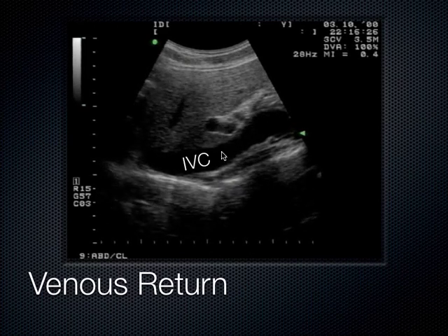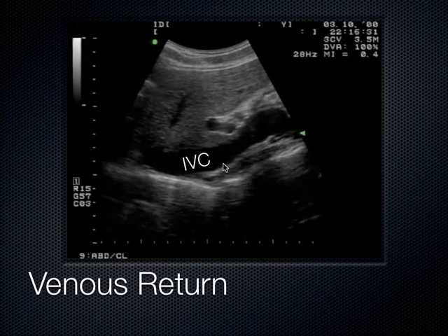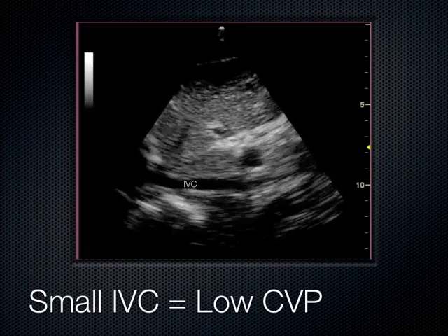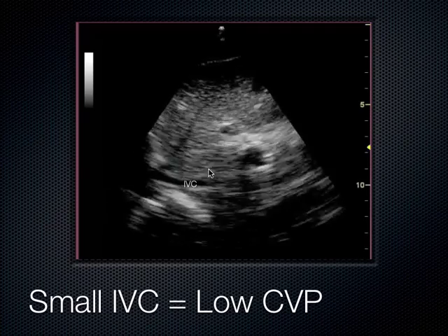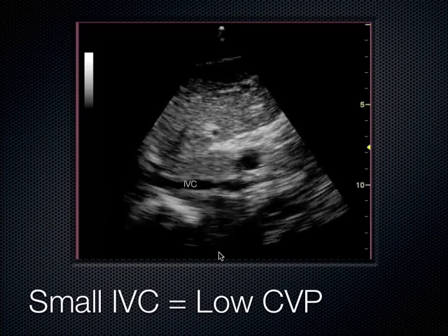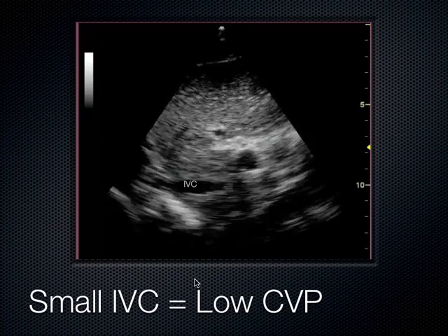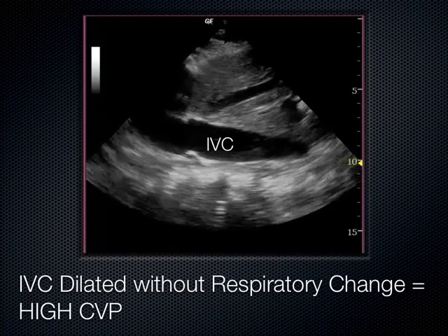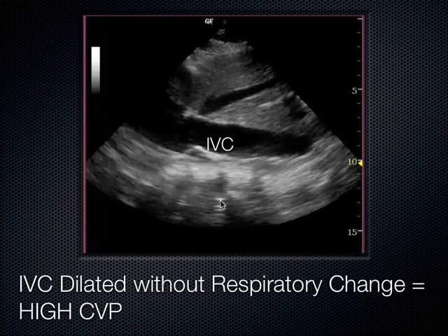This is a patient who's breathing in and out. There's absolutely no change of their IVC. If I had to look over here at these calipers, maybe it's about 1.5 or 2 centimeters. I'm not dropping calipers here, but I'm just demonstrating that. Here's one that's a really small IVC that as they breathe in, collapses down. And we can see this collapsibility going on. As they breathe in, it just completely obliterates. So that's a really low CVP. This is somebody where I'm opening up the IV fluids. Another example here of a dilated IVC, no respiratory change, high central venous pressure.